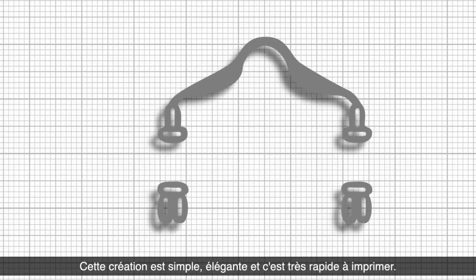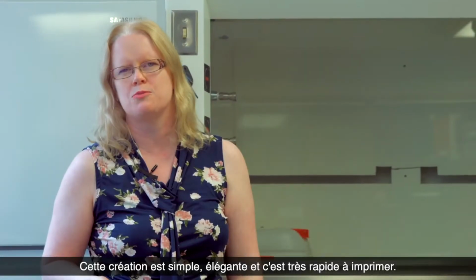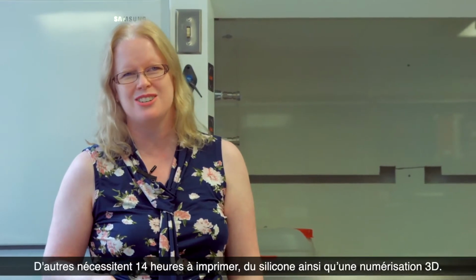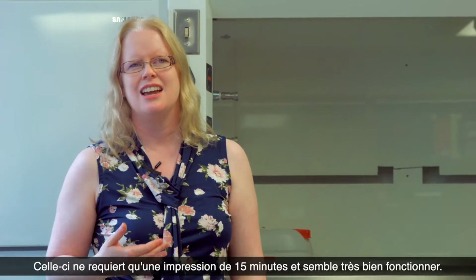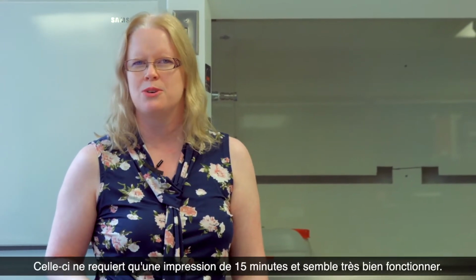This design is simple, it's elegant, it's very quick to print. Other designs are 14 hours to print, require silicone, require 3D scanning, and yet this one, it's just a 15-minute print, and it seems to work very, very well.